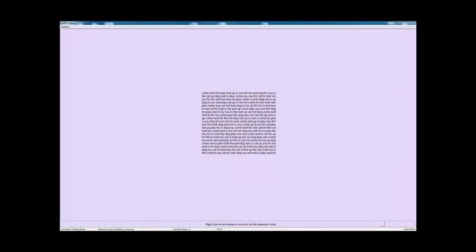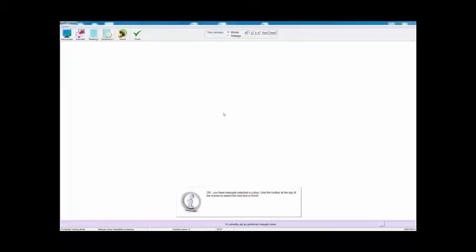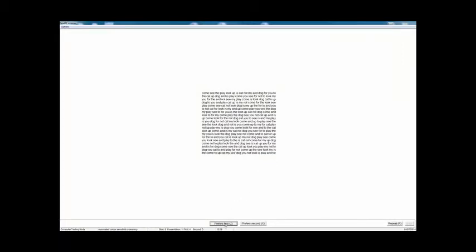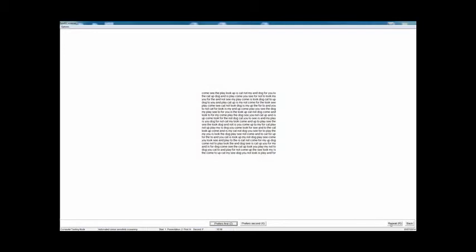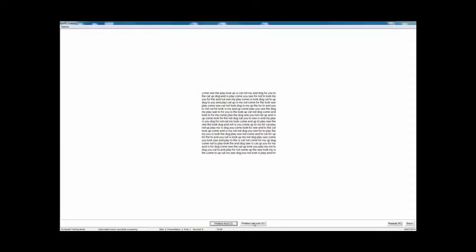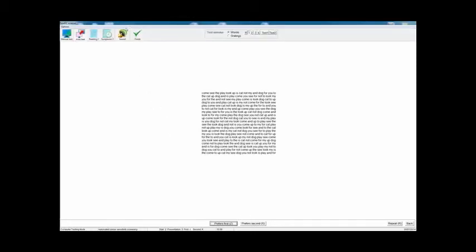This is the manual test — it just allows you to show each of the colors one after the other. Or you can again select the auto test. If you decide by the manual test that's the preferred color, you just right-click on the color — you'll see H is currently set as the preferred manual color. But normally you would do an automated test. This just reminds you that you should have the room lights turned off. You'll see that it presents two colors, but this time they're presented one after the other, and the patient simply says which of the two they prefer — the first or the second. You can repeat it if they're not absolutely certain, and it goes all the way around comparing every color with every other color, exactly the same way as with the overlays. It takes slightly longer because the two colors are shown successively rather than simultaneously.